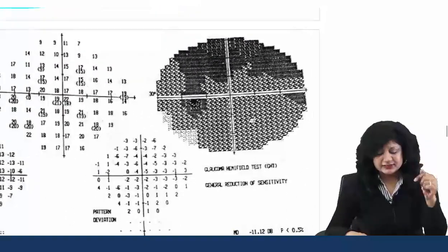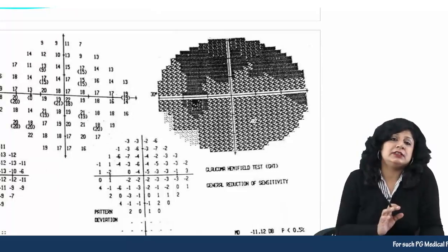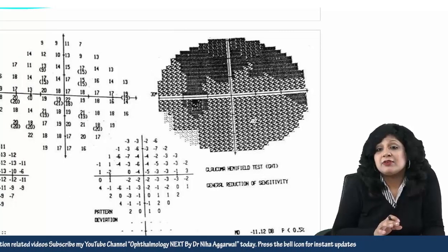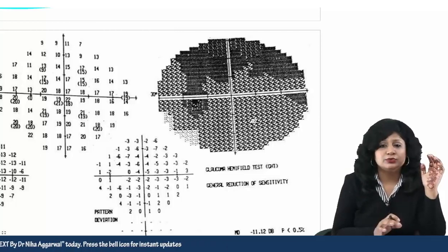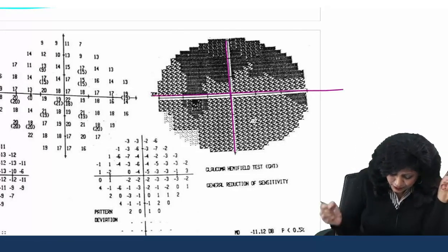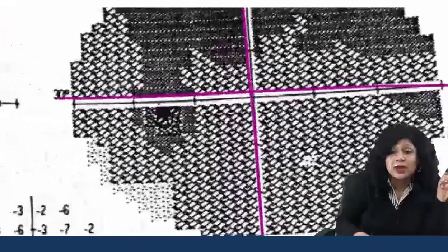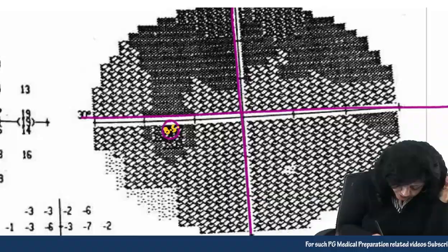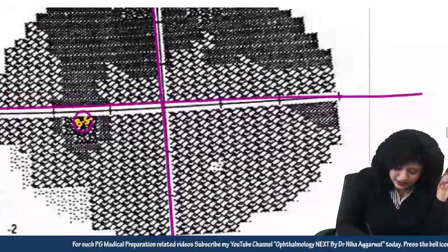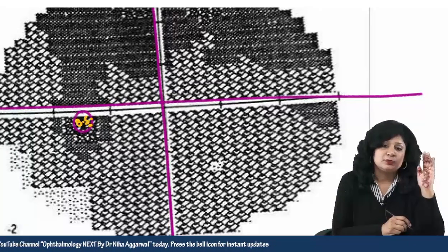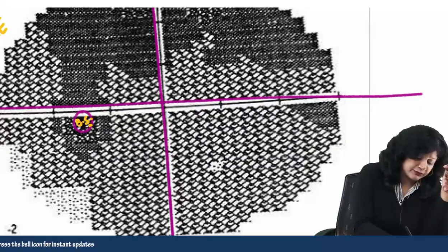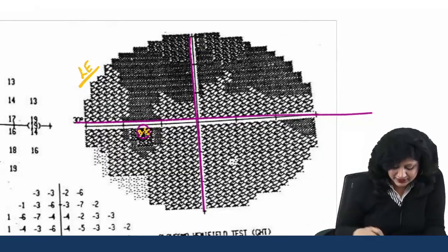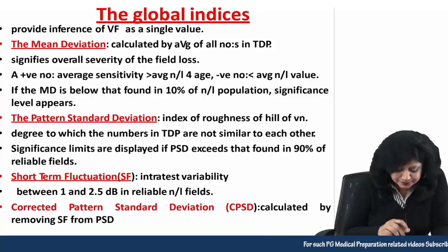Now let's try to identify which eye this printout belongs to. The eye designation is written on the printout, but suppose it's hidden. You have to look for the blind spot — the most dark area on the field. If the most dark area is on the left side, that side is the temporal side, so it is a left eye. If the blind spot is on the right side, it is the right eye. It's as simple as that.